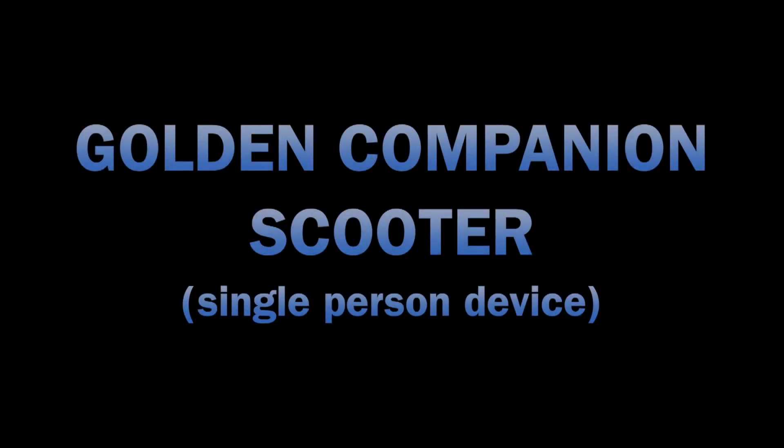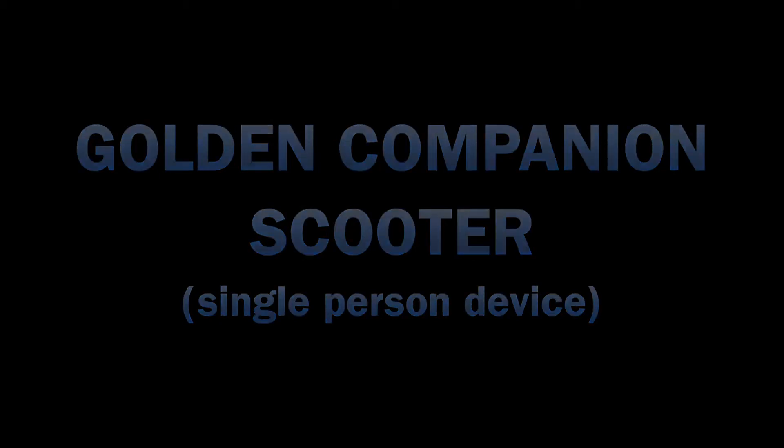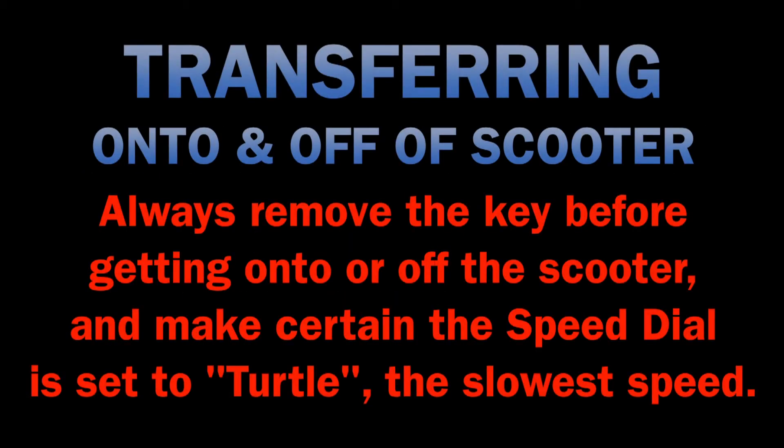Golden Companion Scooter. This is a single person device. Transferring onto and off of the scooter. Always remove the key before getting onto or off of the scooter, and make certain the speed dial is set to Turtle, the slowest speed.